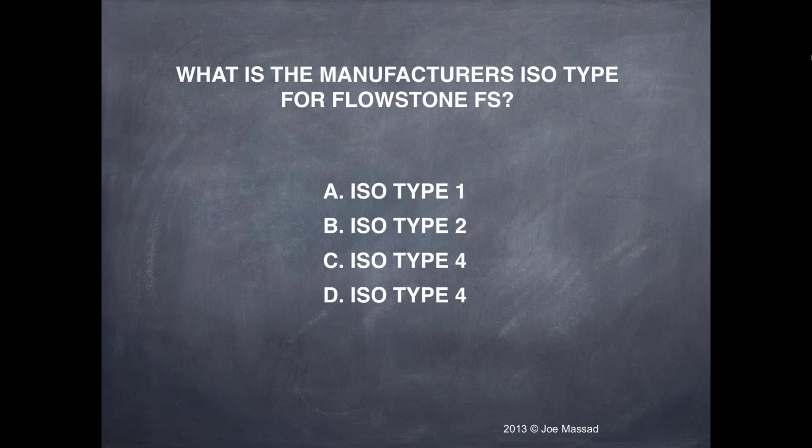Don't take it out and think about it, because by the time you get to the patient's mouth, it ought to be hard. So when you know it's that temperature, you inform the patient, prepare them. It's going to be warm enough, put it in your mouth. Never had anyone have any issues with it. We had studies done at Tennessee at the graduate department because of the rapid cool. So at 165, you're limbery.